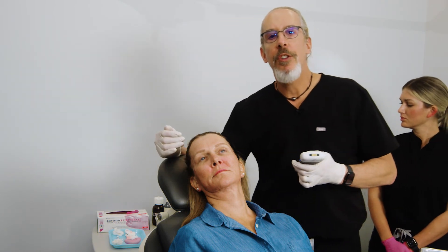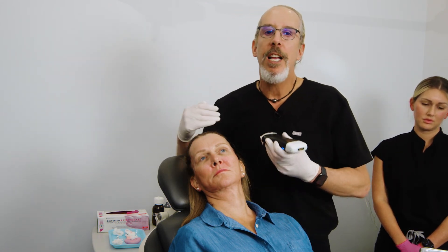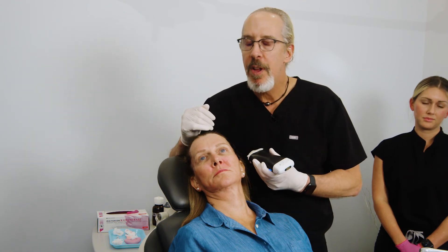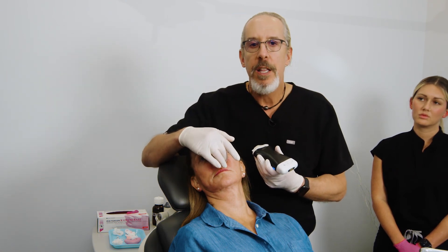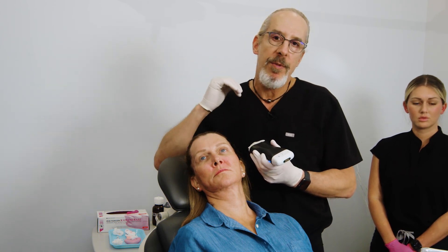In conclusion, the Clarius L20HD was able to identify the arteries in the injection area, and I could inject free from those arteries with much confidence that I'm not going to be injecting within the artery. The patient has more confidence and feels more secure that the injections are going to be exactly where you want them. You can confirm placement afterwards using the Clarius, document it, and put it in the patient's chart. I don't think there's a better way to inject some of these areas - the temple, the pyriform, and the mandible - without using ultrasound. If you're using ultrasound, you can guarantee that you are going to be above or below the vessel, stay out of trouble, and have better outcomes and better safety.